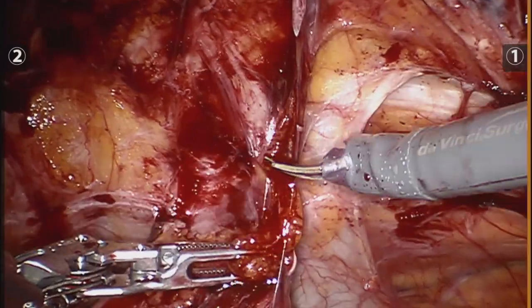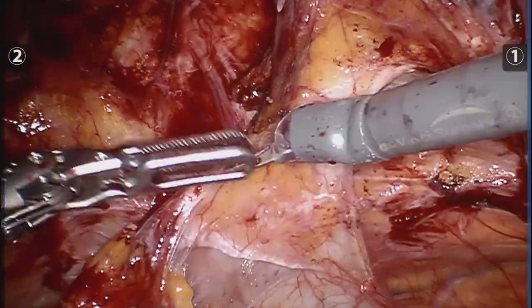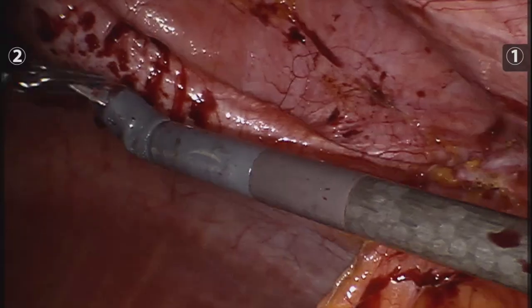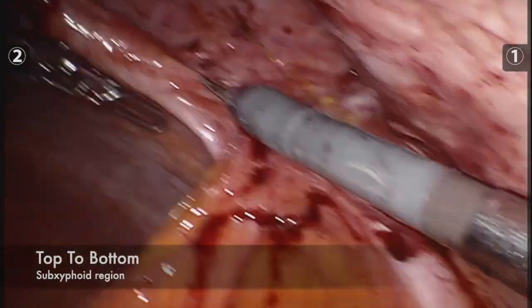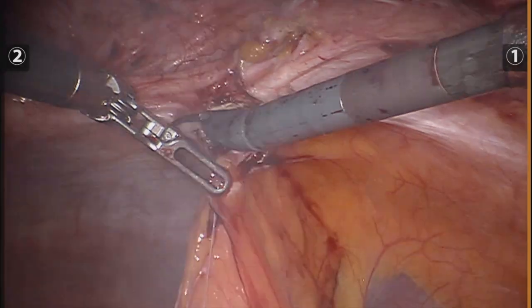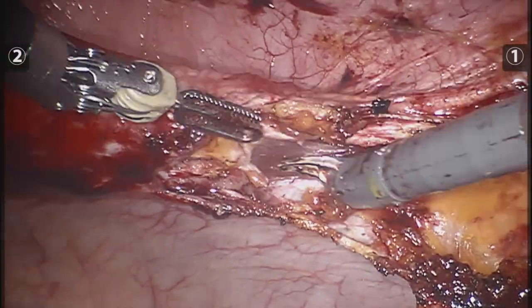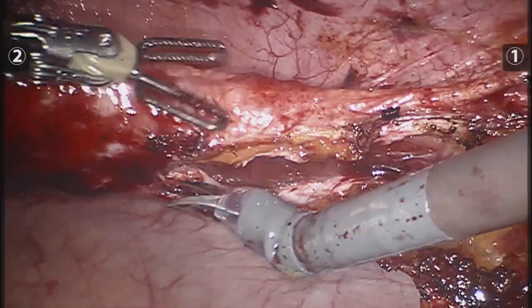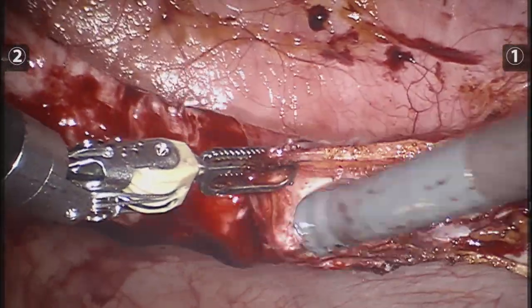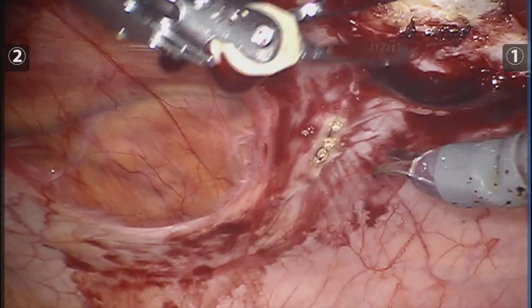The speed of the video, by the way, is 4x. I didn't want to bore you with a too-long video or the careful slow dissection from the beginning. So we're finally in the subcyphoid region. I started my incision on the round ligament of the liver to get into the preperitoneal space, and once achieved, we find the posterior rectus sheath and make an incision on it following the rectus, trying to develop the space that will later allow access into the transversus plane.